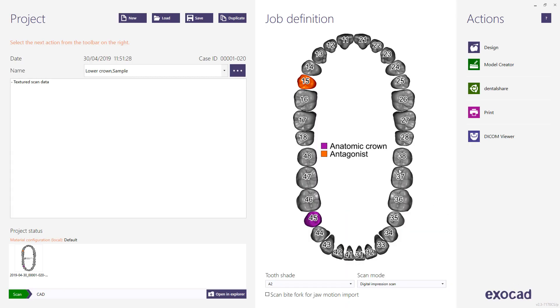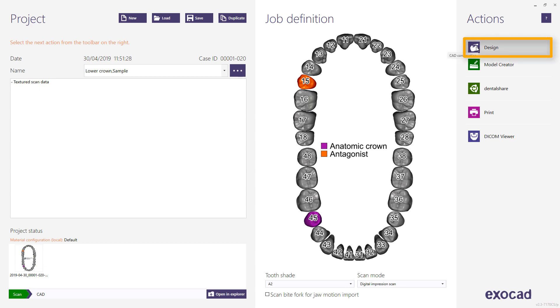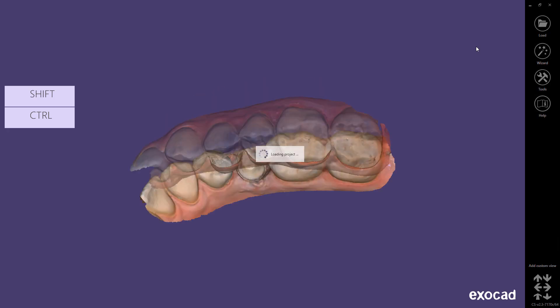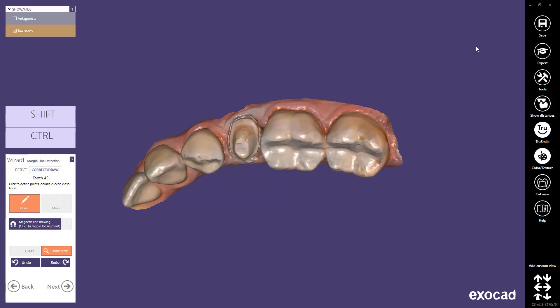This sample job definition includes an antagonist. Next, choose Design from the action menu to start the CAD application. The software automatically starts a wizard that will guide you through all the work steps.